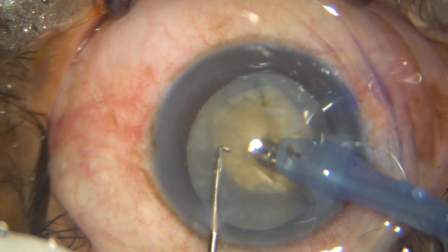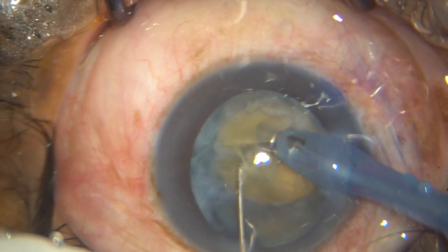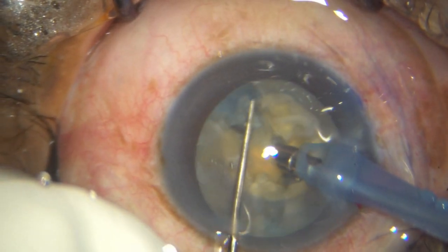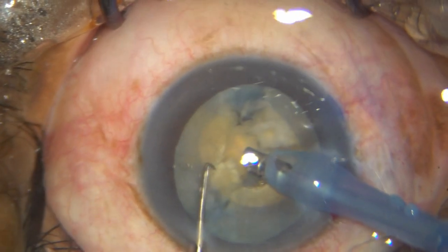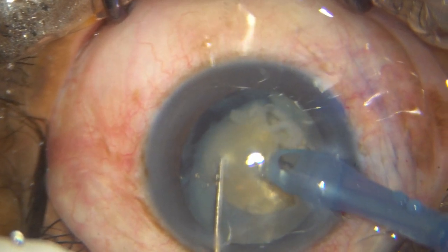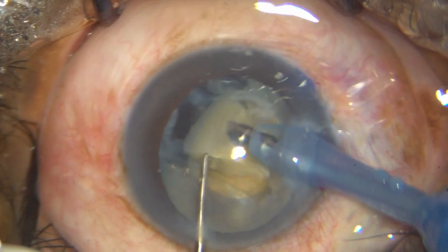So my plan is to make at least 4 segments, 5 to 6 at the most. Don't make too many. This is a very mobile nucleus, so you don't want too many pieces flying around. So the whole idea here, although this is a big piece, I decide let me handle the heminucleus first, and not exactly in the center of the heminucleus. That's because you just cannot control the movement of this nucleus.